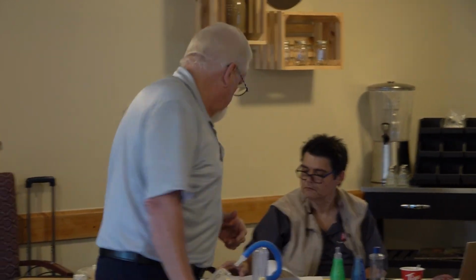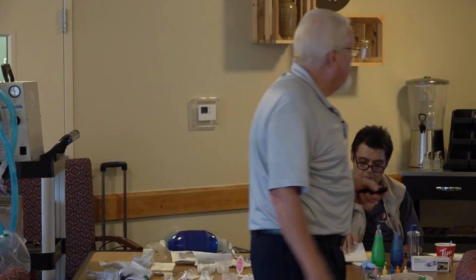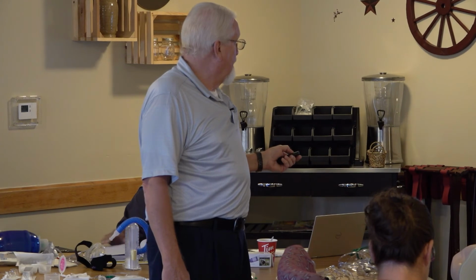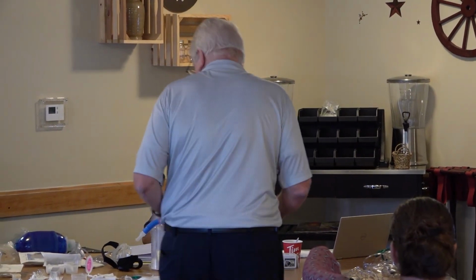And then also with the ballards for your ventilated patients, those are self-contained anyway. Let's see, supplies, we've gone over all of that.